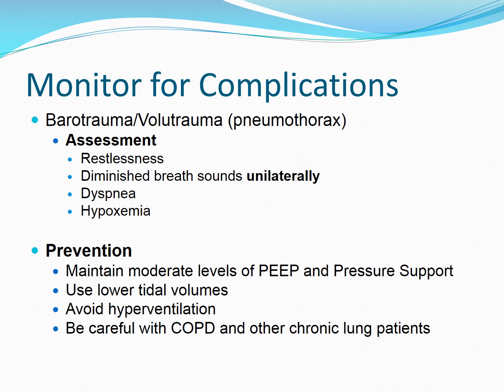Barotrauma, we already mentioned. What happens is we need to be very careful, because we need to watch for this pneumothorax. And that pneumothorax is caused by that increased pressure or increased volume in that lung. And so we have to then be very cautious and assess for that pneumothorax.